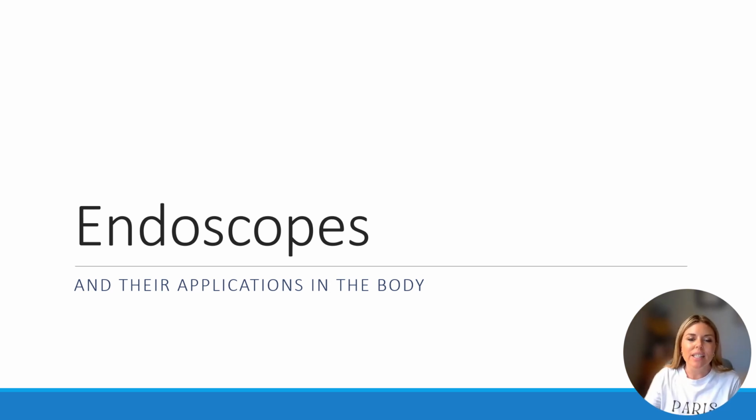Hi everybody, this lecture is on endoscopes and their application to the body or in the body. We have different types of endoscopes. We have flexible, we have rigid, we have semi-rigid endoscopes. And they are specialized for the part of the body they will be viewing.